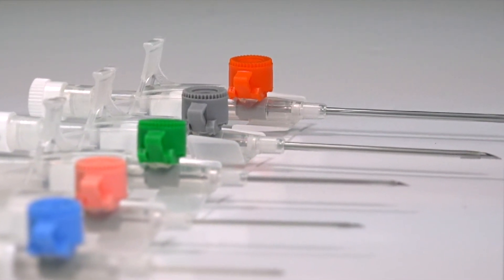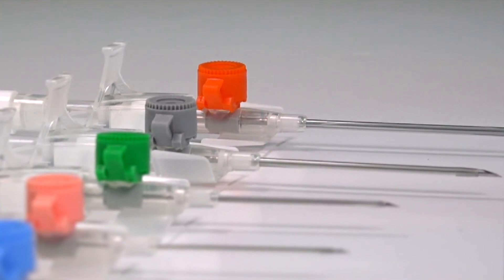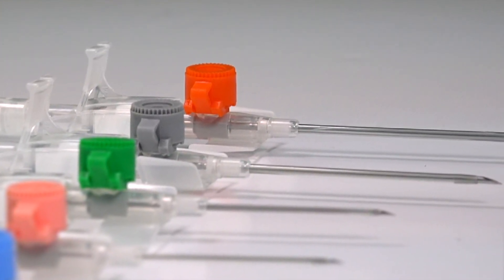The greater diameter lumens of these larger size cannulas allow for faster intravenous delivery of fluid, and thus a more rapid resuscitation.